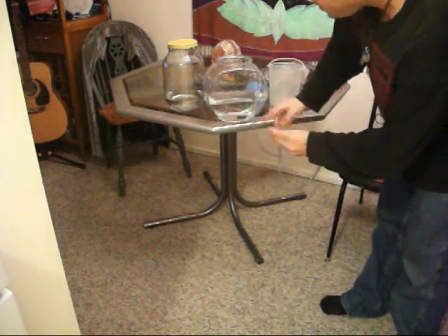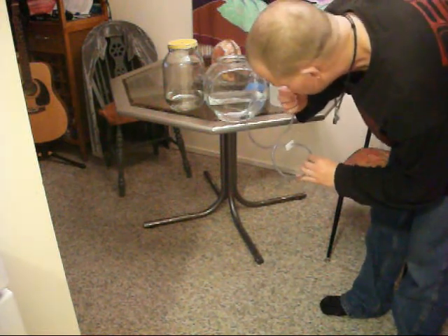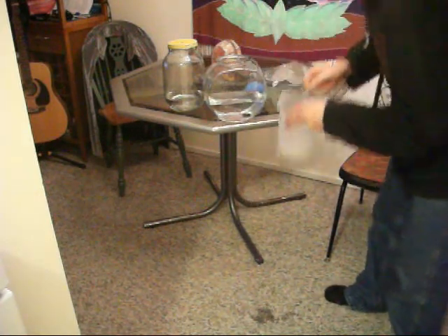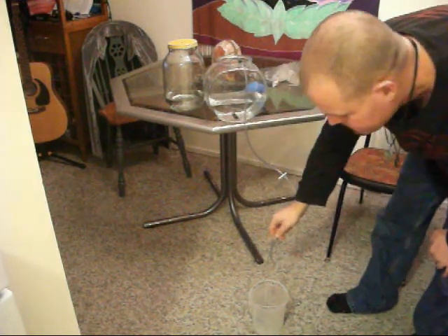So another way, if you have friendly stuff in there, you could just siphon it like this, and then see it's going. Here, we'll tap it in there. So you just siphon it like that, and it goes.